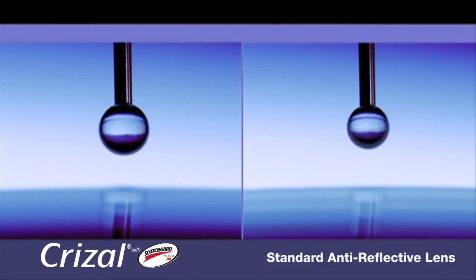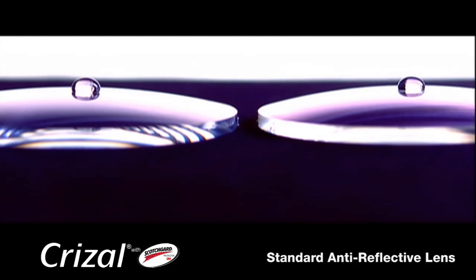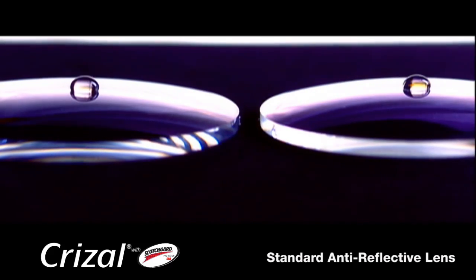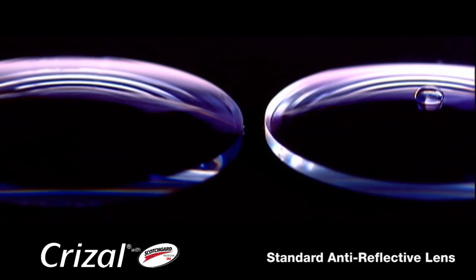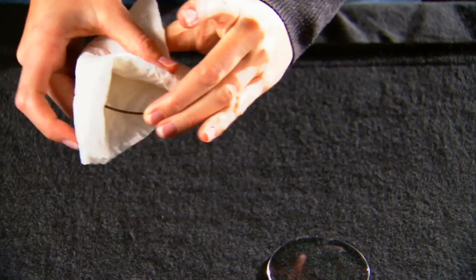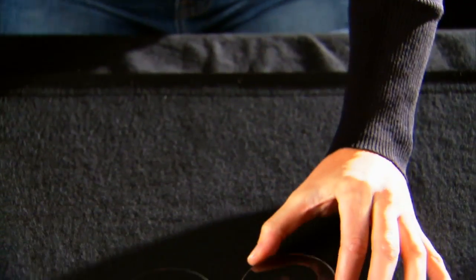Chrysal lenses with Scotchgard Protector also repel water. This allows a bead of water to slip off the lens much easier, demonstrating cleanability. Watch how quickly a bead of water slides off the Chrysal lens. Chrysal lenses with Scotchgard Protector resist dust and lint so your lenses stay cleaner and clearer for longer.